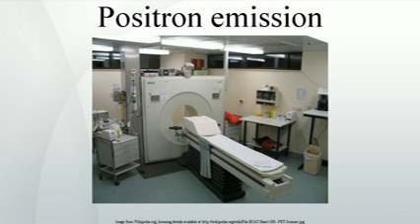A clear disadvantage, however, is that PET provides no timing information about muscle activation, because it has to be measured after the exercise is completed. This is due to the time it takes for FDG to accumulate in the activated muscles.